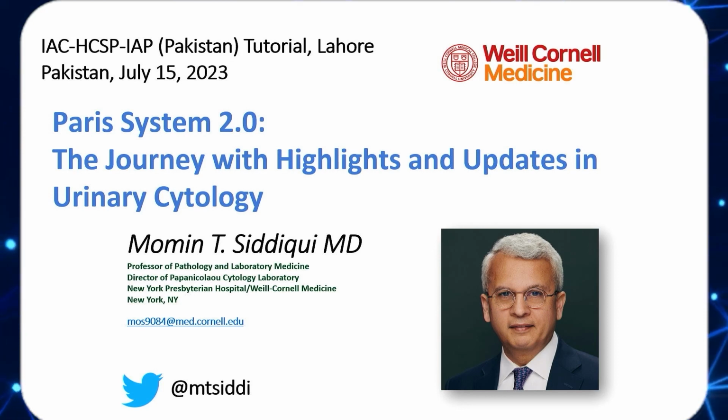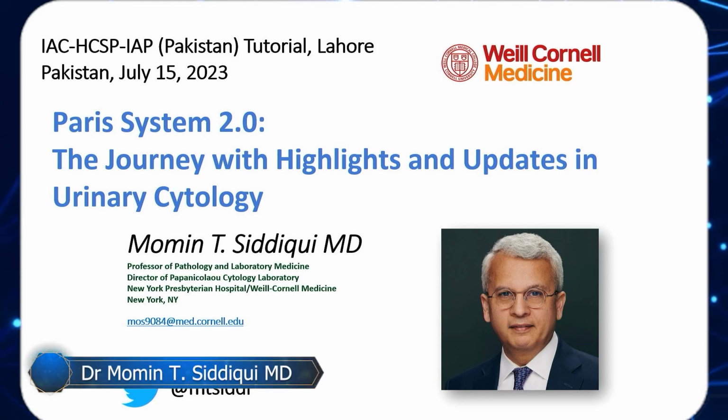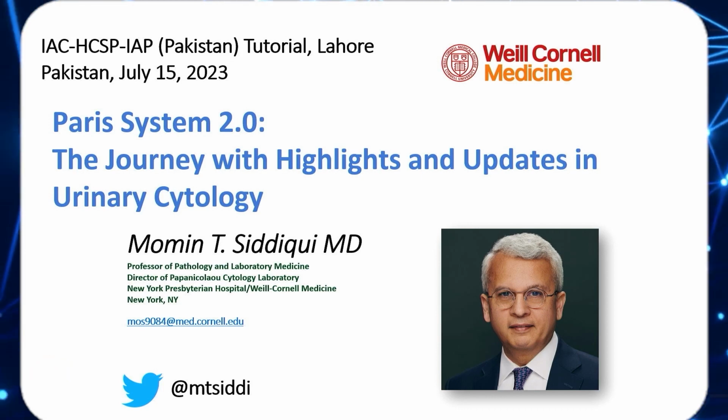So with that, let me start out with my first presentation today talking about urine. It's again really impressive to see a big turnout. Urine is basically a waste product, so that's what people have been telling us. Why do you even look at it? Especially some of the most seasoned surgical pathologists, not in this audience, but that has been some of the feedback I have gotten. So the journey today would be highlighting updates of urinary cytology, which I have gleaned over my experiences in the last 10 years or so of having worked with the Paris system.